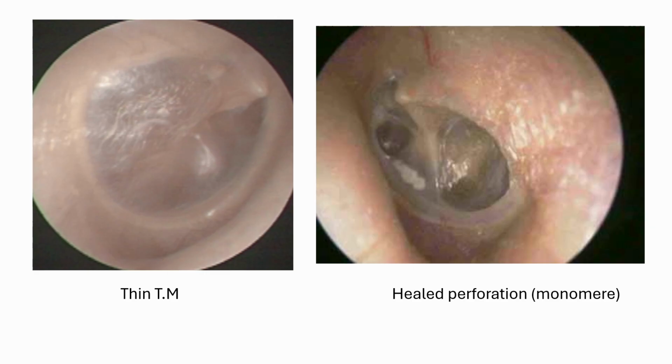It will be differentiated, whether it is a normal finding or the patient has a problem, by testing audiometry or the tuning fork and the whisper test. If there is normal hearing, then it is of no concern, this type AD. But if the hearing loss is around 50 decibels or more, then it means it is ossicular discontinuity.